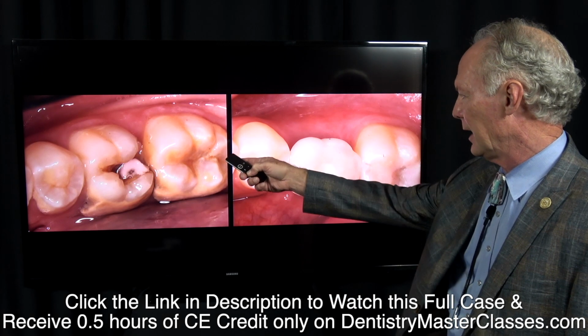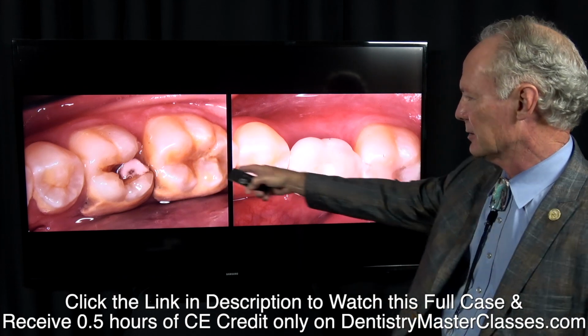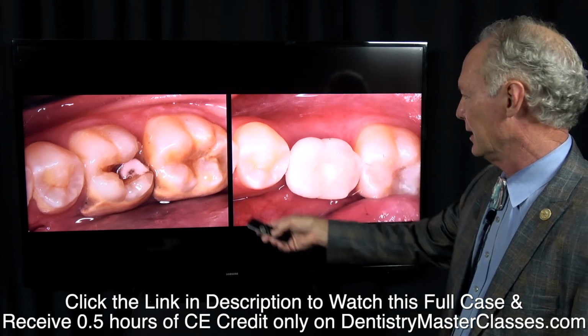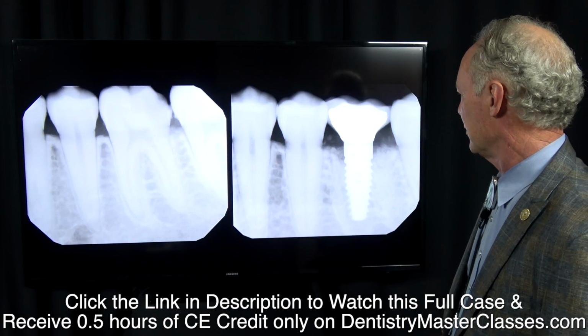This is a before and after. I'm extracting this lower left first molar. It's taken in a mirror, so it looks like the lower right side, but it's actually the lower left, number 19. And this is the final implant. Here's the implant in place with the crown. It's a screw retained crown.